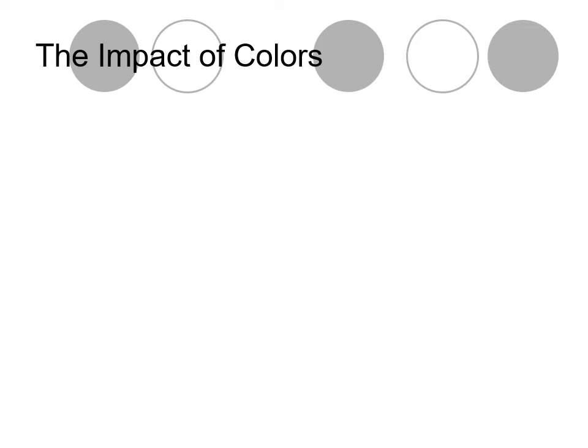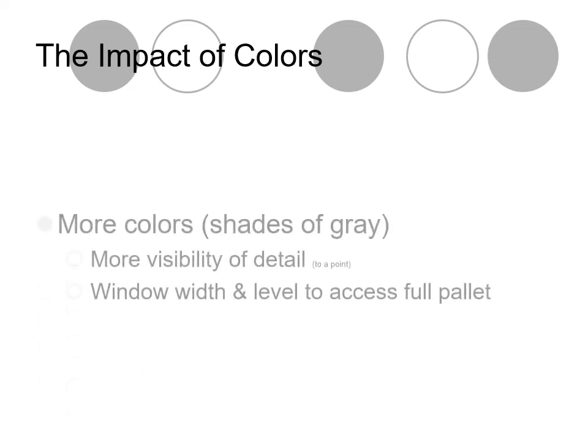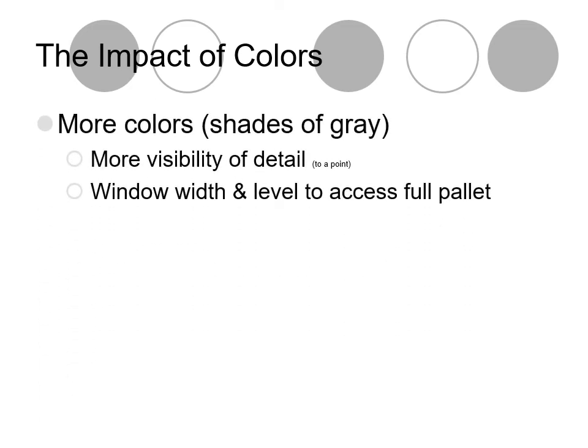Theoretically, the more shades of gray possible on an image, the more information that image will convey. The more gradations of shades of gray, the more structures should be visible on an image. Don't expect to see much difference on your system monitors.